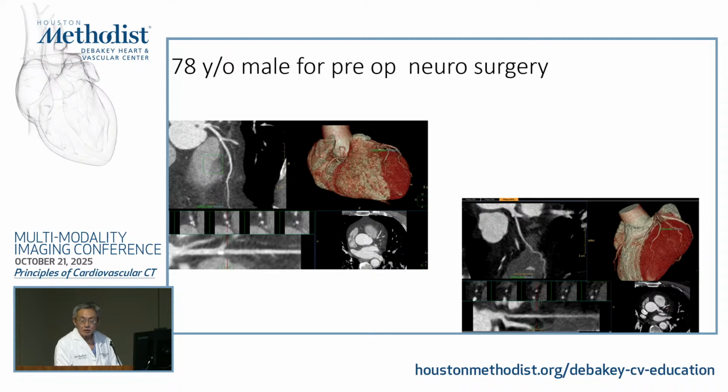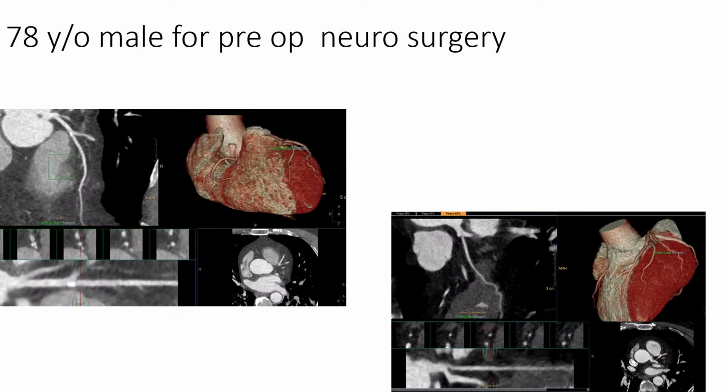because as I mentioned, since the scanner can acquire the image really fast, we are able to do what we call free breathing. So this is a patient, I think Patrick knows about this case, and our imaging fellow. This patient is a patient with dementia that essentially can't follow command, and the neurosurgeon insists to do some pre-op coronary. So the first thing you ask is, is the patient hyperventilating?